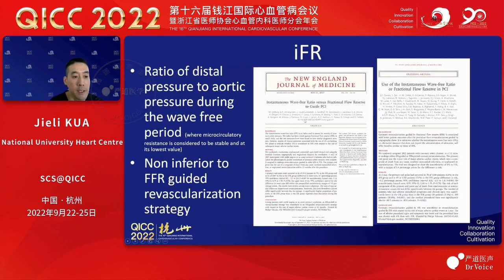So over the last few years, what has emerged is the iFR. iFR is different in that it's a ratio of the distal pressure to the aortic pressure during what we call the wave-free period. It's believed that in this wave-free period, the microcirculatory resistance is stable and at its lowest value. The two trials, DEFINE-FLAIR as well as iFR-SWEDEHEART, show that iFR-guided revascularization is non-inferior to FFR-guided revascularization.